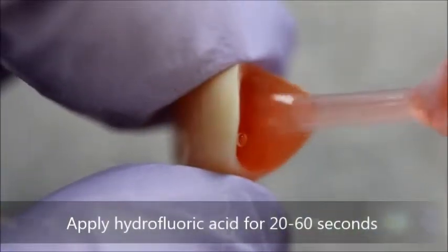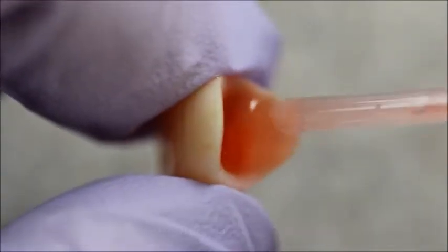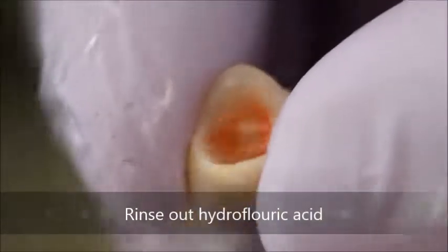The first step is to etch the inside of the crown for 20 to 60 seconds with either 5 or 9 percent hydrofluoric acid. Note that the lab may have already performed this step for you, and I suggest contacting them to verify.